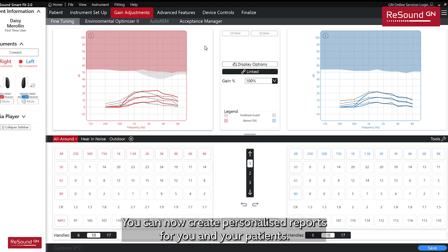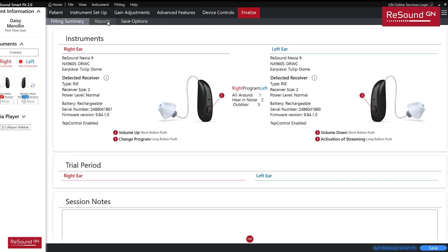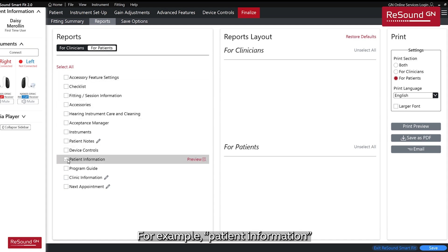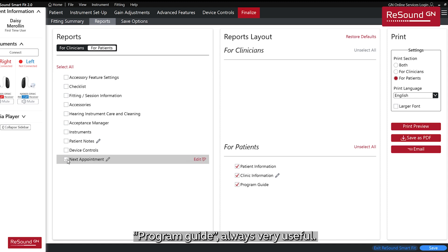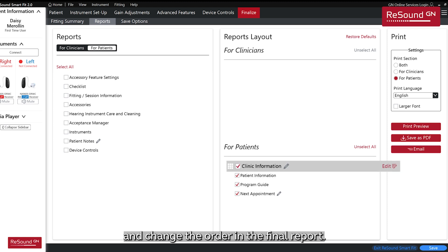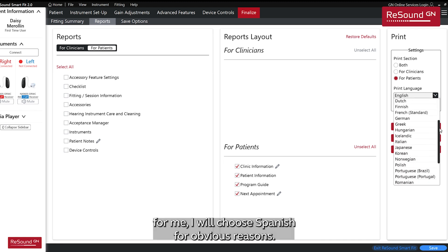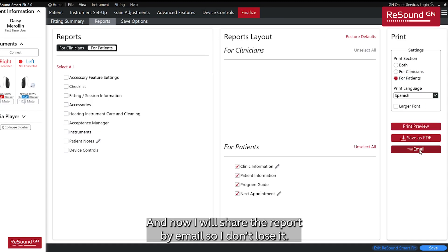You can now create personalized reports for you and your patients. Go to Finalize and select Reports. From this list, you can select the information you need — for example, Patient Information, Clinic Information, Program Guide, and Next Appointment. They appear in the report and you can customize them and change the order. You can also change the language, which is great if your client feels more comfortable in a different language. Then share the report by email so you don't lose it.